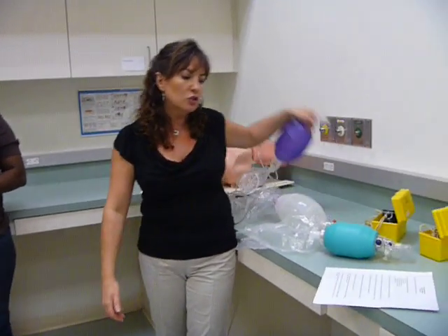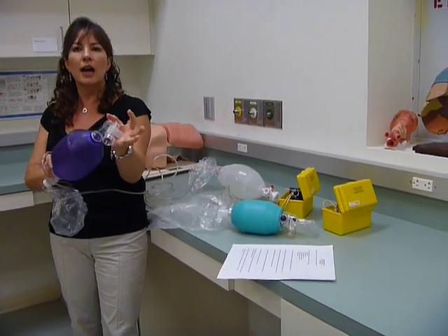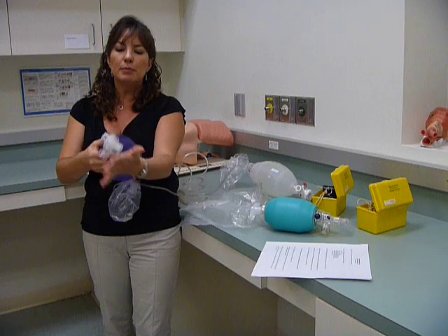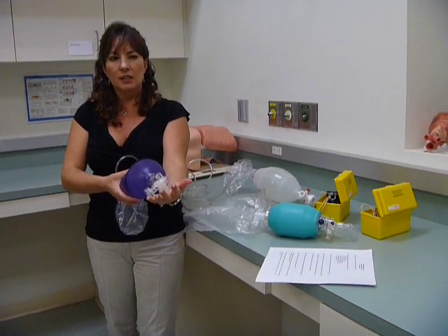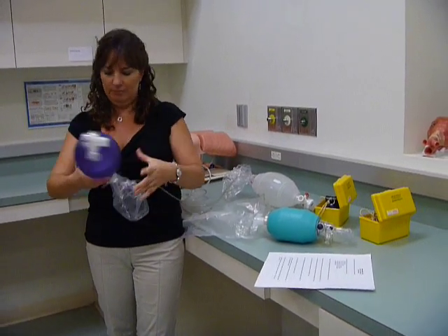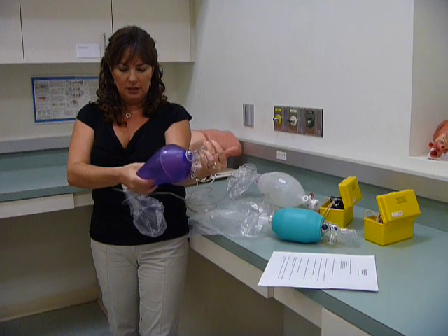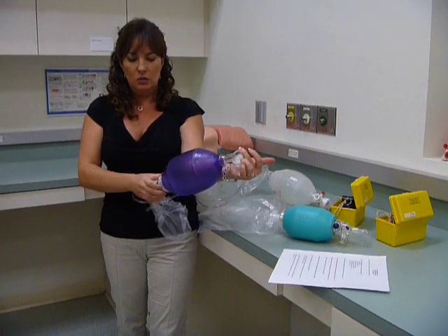Then you're going to pressure check the bag to ensure there are no leaks. To pressure check, take off the mask, occlude the outlet port, and squeeze it — you should not be able to squeeze it. If there was a leak somewhere, you could squeeze it because air is escaping even though I have occluded the port. So you're pressure checking it to make sure there are no leaks. If you can squeeze it, there's a leak someplace.